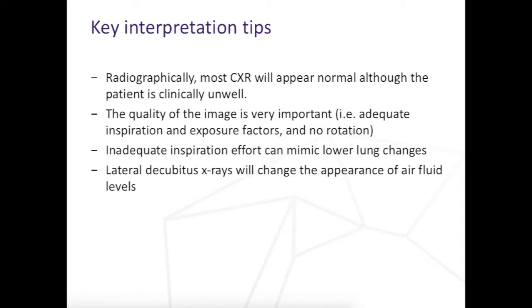So when will you do a lateral decubitus chest x-ray? One of the only real reasons why you would is, for example, if the patient has gone to surgery and has had a lot of abdominal, posterior, back, buttock, leg surgery where they physically cannot sit up or lay supine. In that instance, we could do a lateral decubitus x-ray to do a line check.